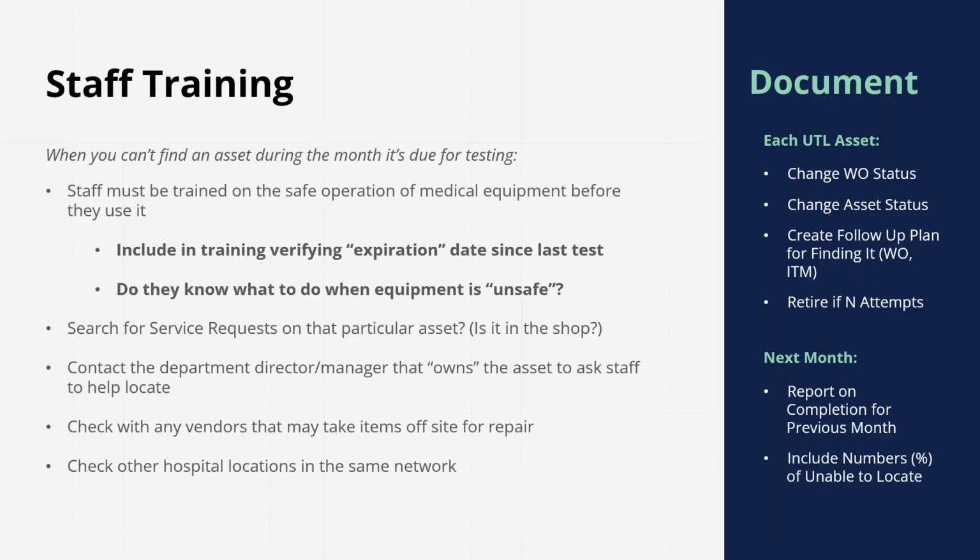Also on the training side of things, what about the clinical staff, the people using the equipment, the people hooking it onto a patient? Are they looking at the tag? Are they trained? I've seen different colored tags for different years, so that if it's out of compliance, they're not supposed to use it or hook it to a patient. So what is that expiration date? Are they including it in their training? Who trains those people to know what your policy is around those and what those look like?